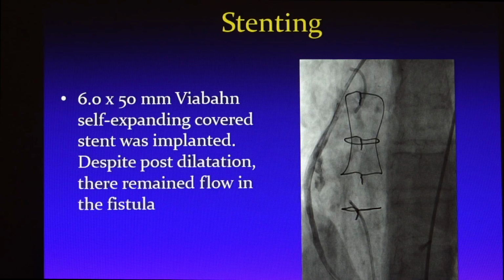So here you can see the guide up there. You can see the wire. You can see the aneurysm there. We got that.